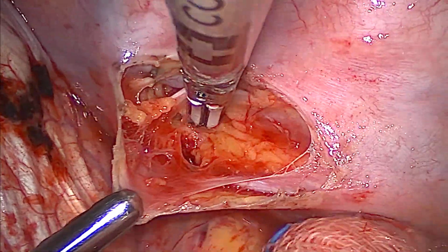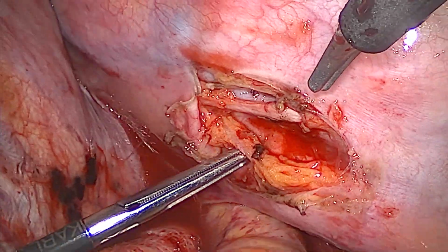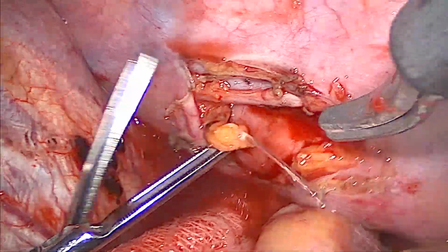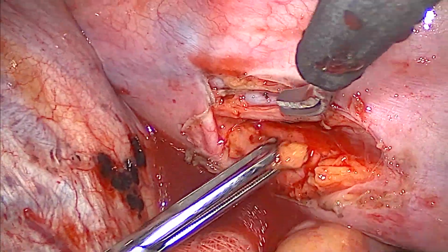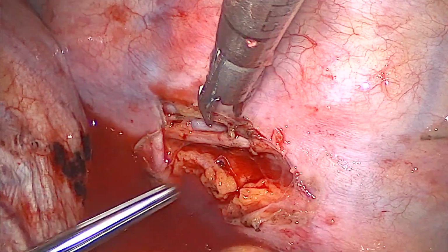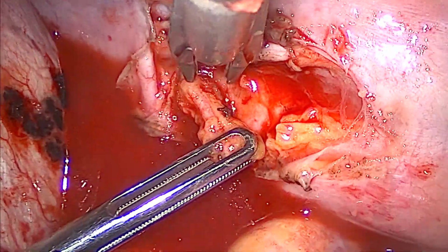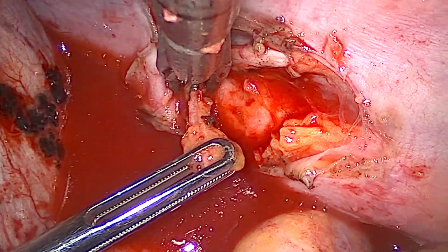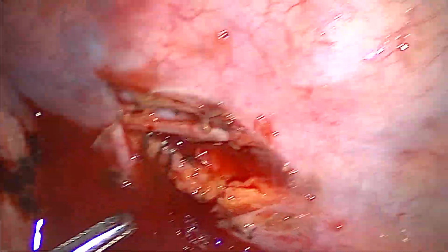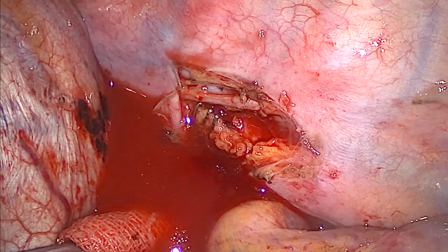Prior to the operation, the patient was given 100 milliliters of double cream orally, around 6 hours prior to the operation. It usually helps to visualize the thoracic duct, and it's easier to find during surgery. So you just saw a gush of chyle coming out of the thoracic duct, following which it was ligated by clipping it. Both the upper and lower ends were ligated using titanium clips, and the branch was also ligated.